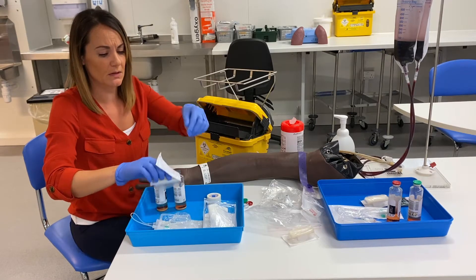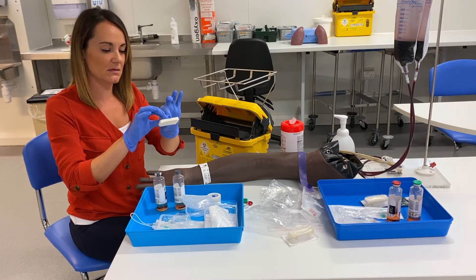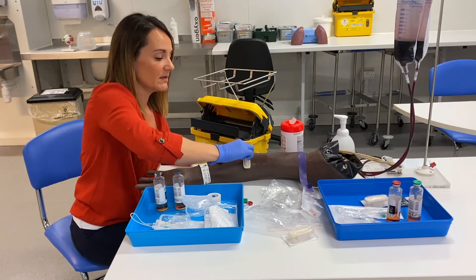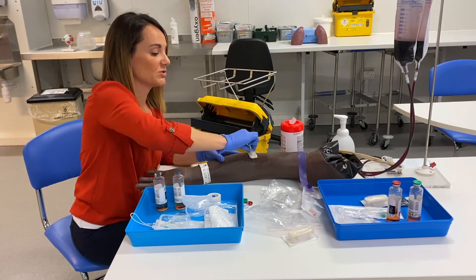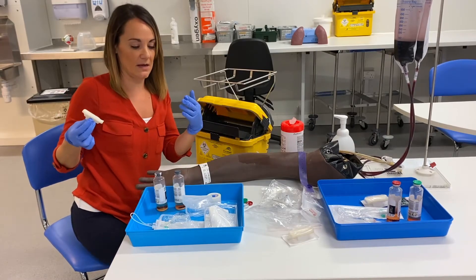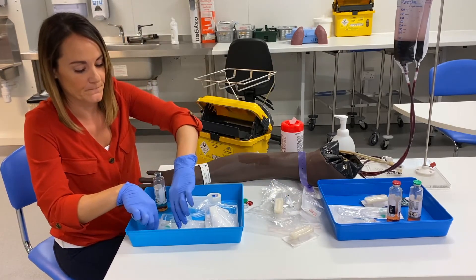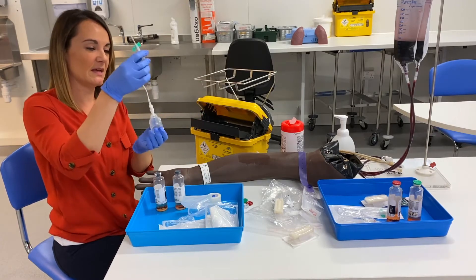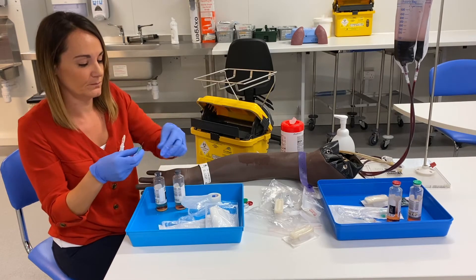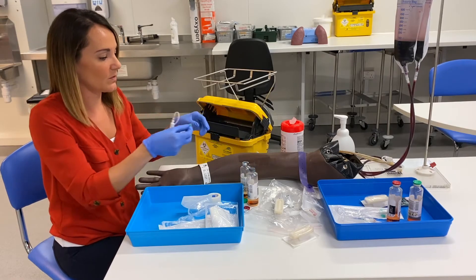The claw prep wipe has a little glass capsule in the middle. To activate it, just squeeze it — you can hear that. Give the vein a really, really good clean slowly in two different directions for at least 30 seconds. Once you've done that, allow it to dry, and always bear in mind how long your tourniquet has been on. Get your butterfly ready — by that I mean it hangs down so that we can attach our bottles safely. Get your butterfly needle and hold it to one side.